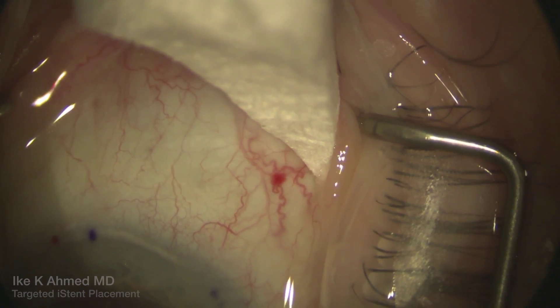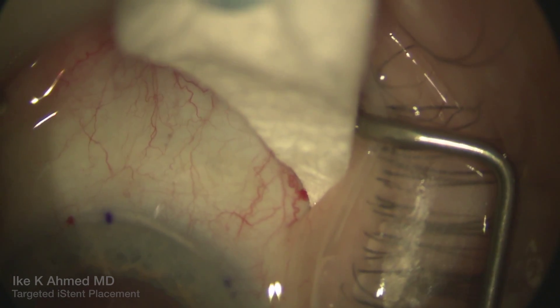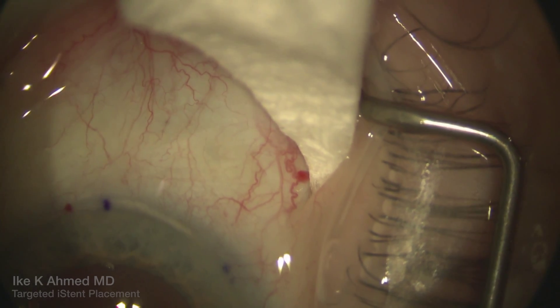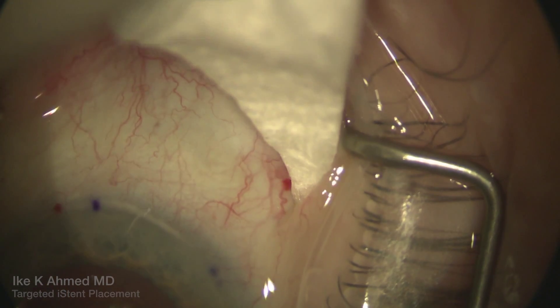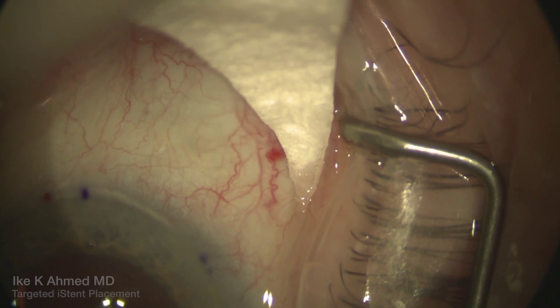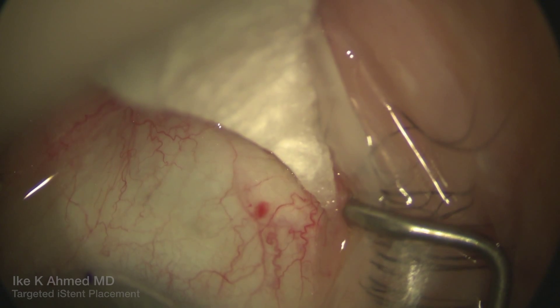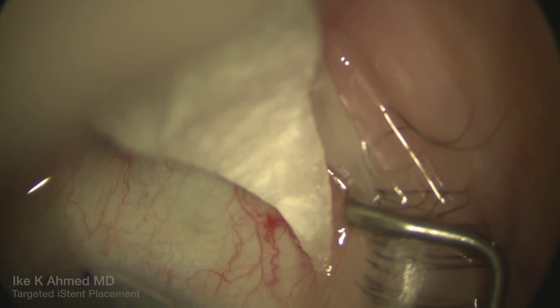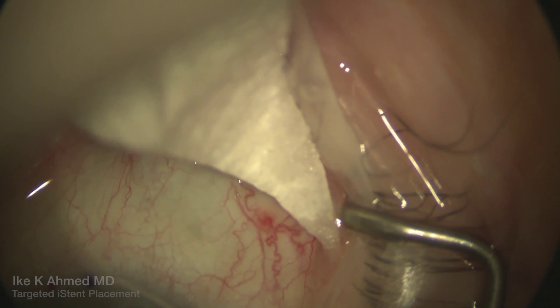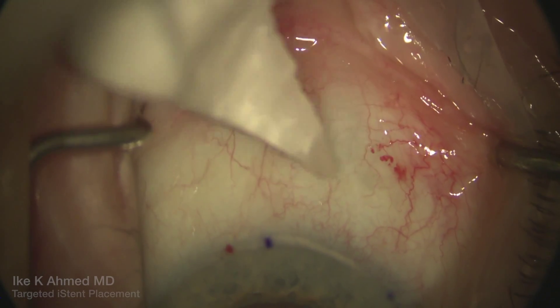This is an interesting vein in the sense that two smaller veins meet up to form it, and it's likely that the placement of the third device near that more nasal vein in the supernasal quadrant made the difference. Theoretically, these veins have high flow rate potentials to substantially lower pressure within the anterior chamber. Some have theorized that engaging simply two aqueous veins may lower pressure to physiologic levels, and so targeted eye stent placement near the aqueous veins may prove to be a further benefit in IOP lowering.